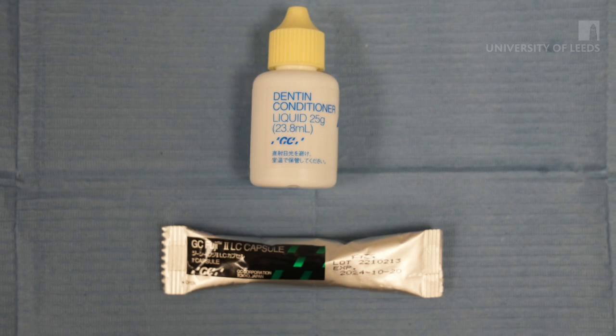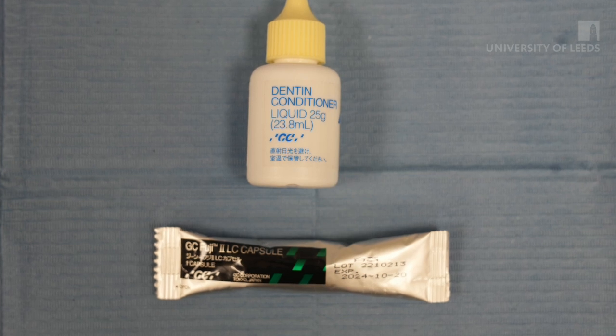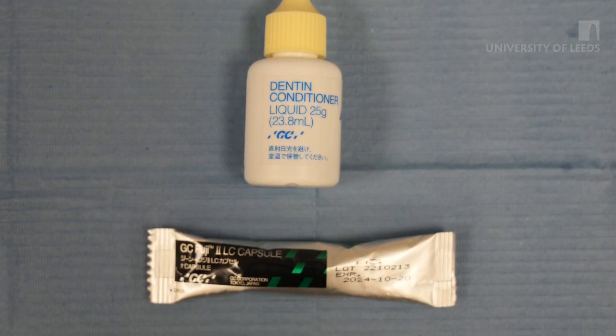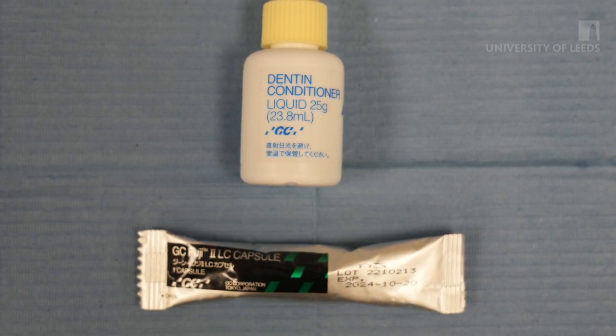For the restoration, we've chosen to use a light cure resin modified glass ionomer cement, which is self-adhesive and hydrophilic with excellent aesthetics and polishability, making it a great choice for class 5 and deciduous dentition.